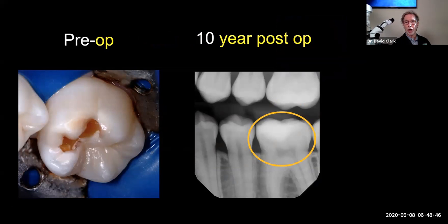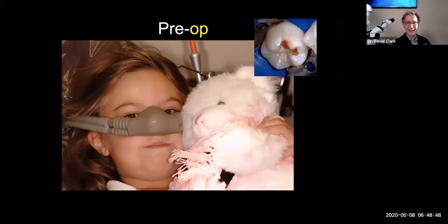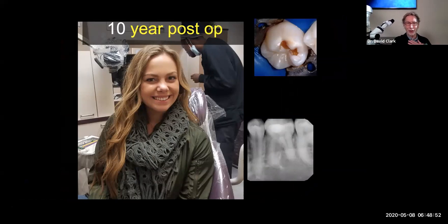So I'm going to show the contralateral side. Here she is at whatever, 7 years old. And here's her 10-year post-op. I feel good. I kept the tooth vital. She didn't need a root canal. So even though that technique was outdated, I'm very proud that I was able to save the tooth, even though today it would be very different. We got away with it because she was young. Let me tell you, you do this in an adult where the pulp doesn't have such a robust circulation, it's not going to go your way very often. They're going to need endodontic therapy a lot sooner.